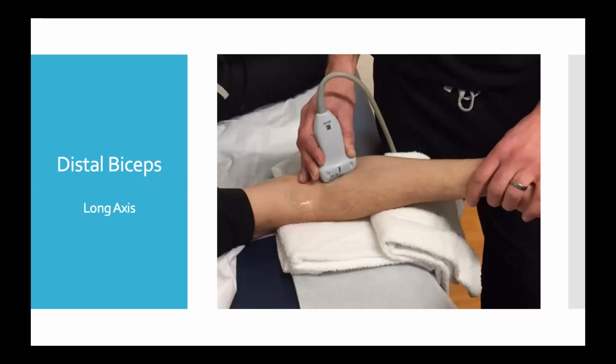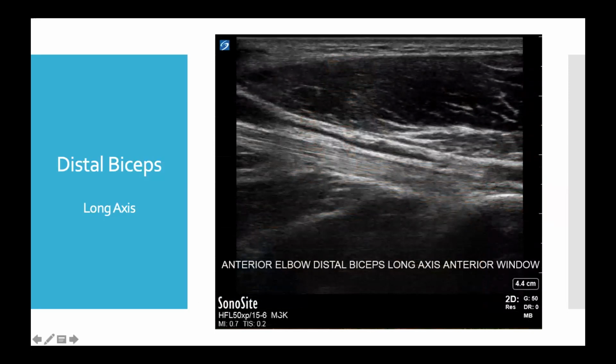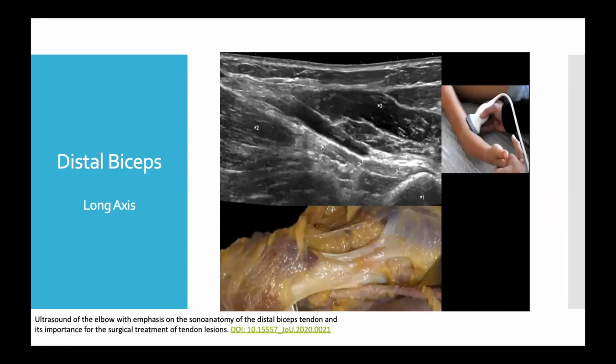Again, here's patient positioning for the distal bicep long axis examination. And this is our goal picture, so to speak, of what we really want to find. We can clearly see a tight fibrillar pattern of the biceps tendon coming down and inserting on the radial tuberosity, and the acoustic window of the brachial artery just superficial to that. You can really appreciate the artery in the video, given that it's pulsating at the time of the examination. Here's another all-in-one slide showing the gross dissection, probe positioning, and what we would expect to see on our ultrasound screen.